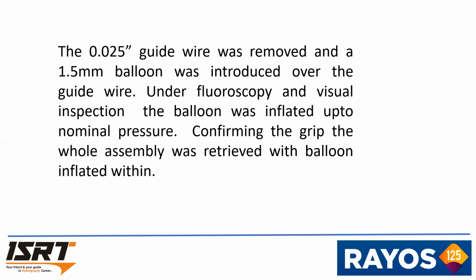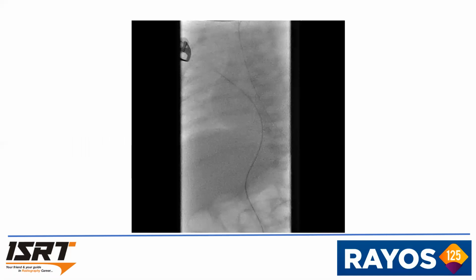It was inflated up to 8 atmospheres, confirmed the grip within the catheter, and the whole assembly was retrieved with the inflated balloon within. It was an inflated picture of the balloon. You can see here.